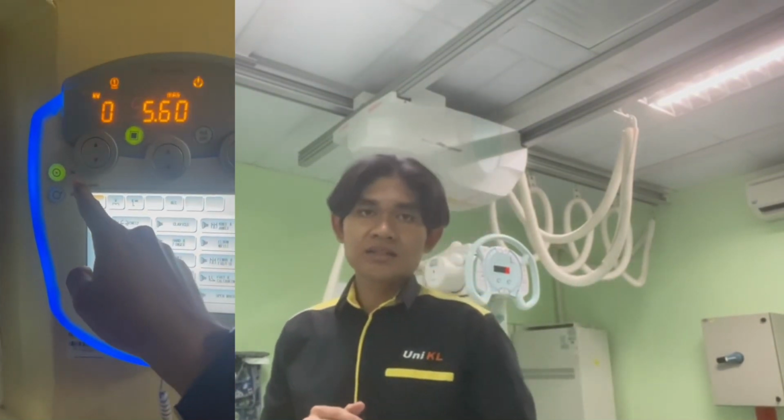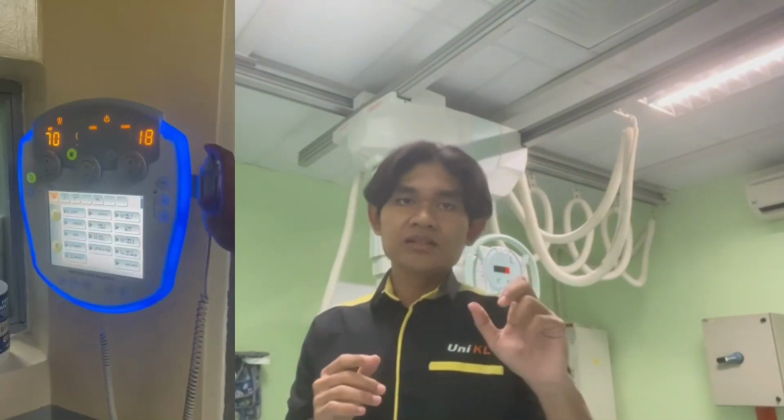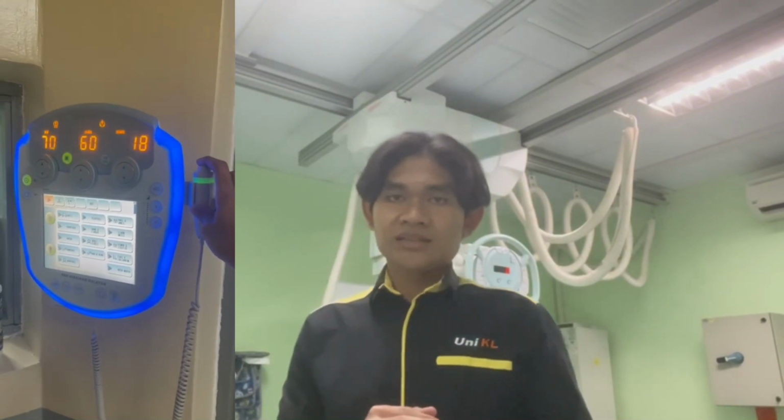First is power button. The icon is a circle with a vertical line. The function is turn the X-ray unit on or off. Next is X-ray exposure button. The icon is a hand pressing a button or labeled X-ray.